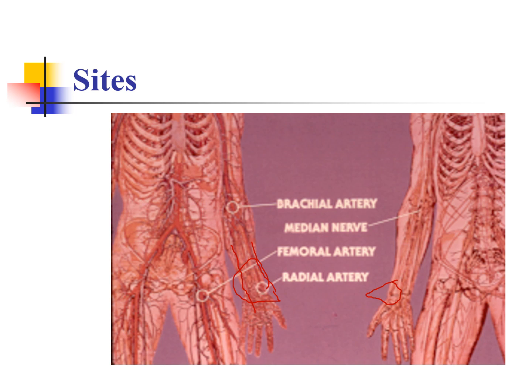The next site is going to be the brachial artery, located sort of on the inside of the elbow there. You could probably feel it on yourself, that inside of the elbow, unless you got massive biceps, which I don't. Then you should be able to feel it on the inside of your elbow. You can feel this really well on kids, generationally advanced individuals as well. This is sort of a secondary location. There is still some collateral circulation here, not as strong as in the ulnar to the hand, but your primary site is going to be the radial artery. It's more superficial at the radial artery too, so you don't have to go near as deep into their tissue. The angle is a lot better for the radial artery puncture as well.